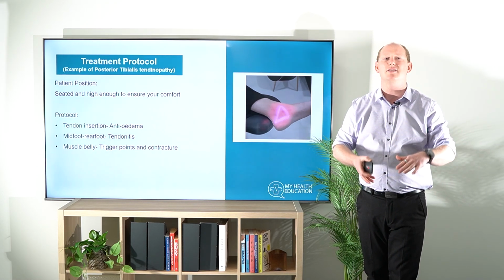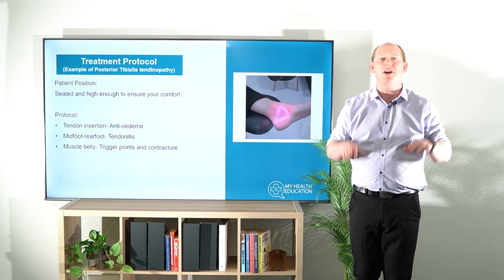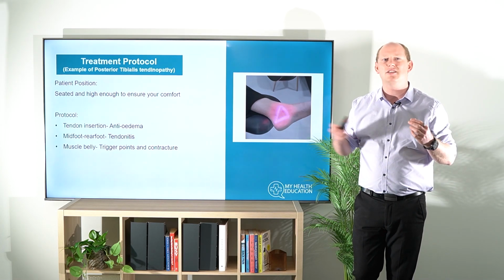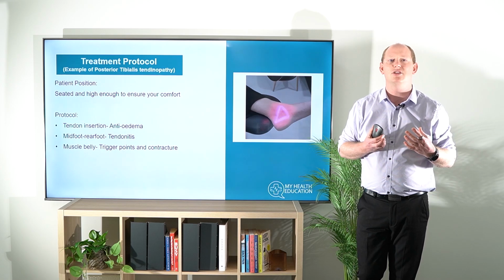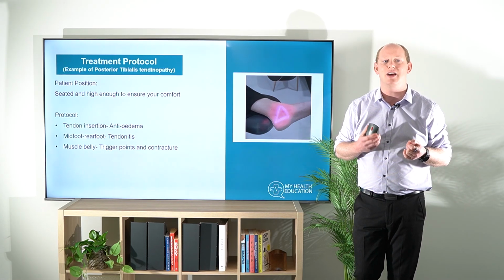Really what we're wanting to do is make sure the patient's in a comfortable position for them, but also for us. And I do harp on about practitioner ergonomics. So make sure that seat's high enough, they're tilted back in my case, and in the case of this photo here, so that we can make sure that the patient is going to be comfortable and we're going to be able to get access to that site as well.